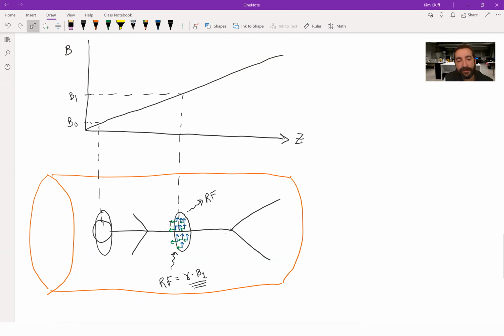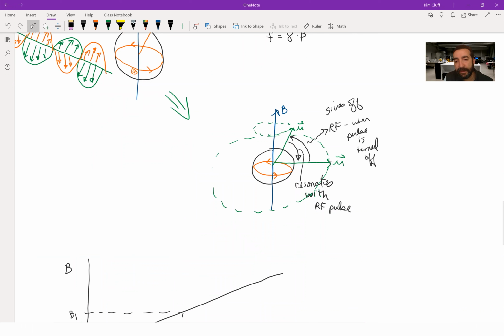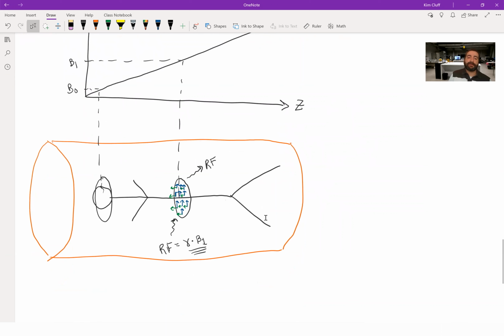The relaxation, I believe, is a T1, where the magnetic moment that gets tipped on its side, when it relaxes back up and realigns with the external B field. This here, if I remember correctly, is called T1. It's the relaxation time, okay? So there's two parameters, and I'll show you guys these in the next class. T1, T2, MRI imaging that produce, again, incredible images of the human body, and this is how it's done.